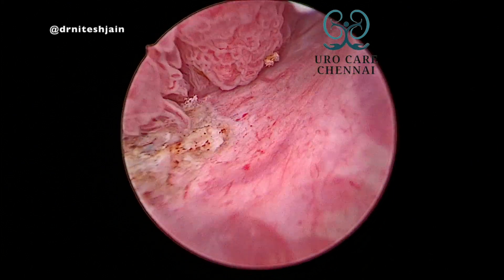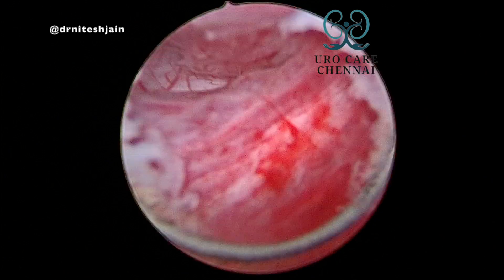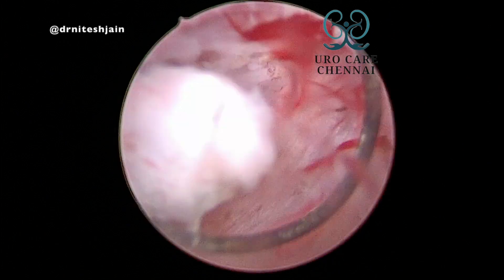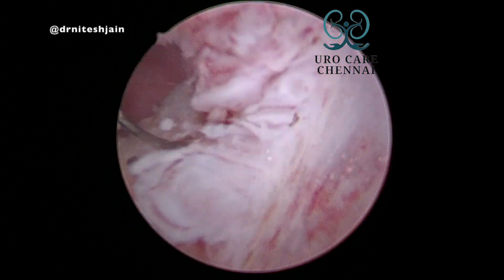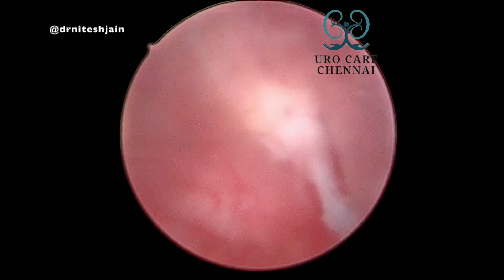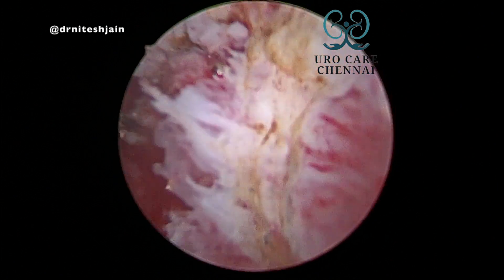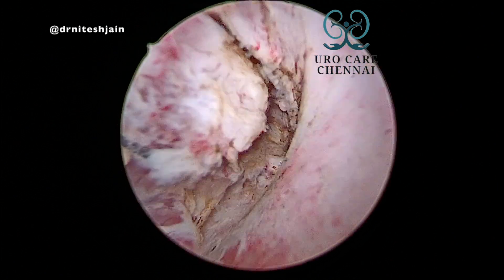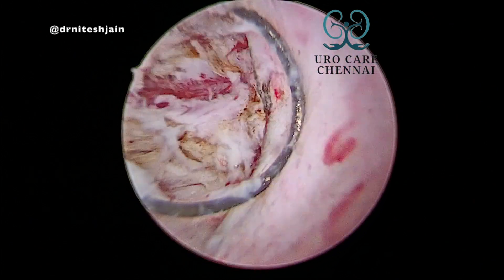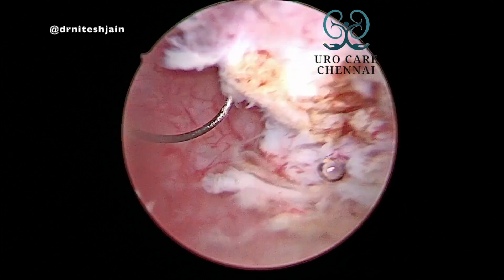The left VUJ was not at all seen despite best possible effort. Once that is done, start cutting the tumour from the base rather than from the top, because if you cut from the top you will face many more vessels. The floor will have fewer vessels, so you can reach the main vessels early, coagulate them, and the bleeding will be much less.